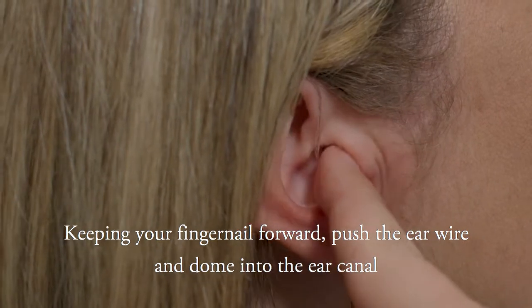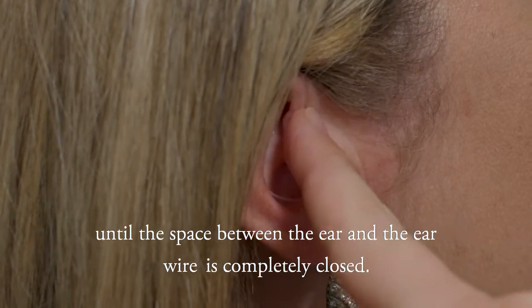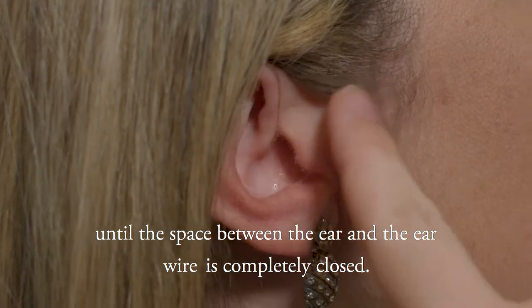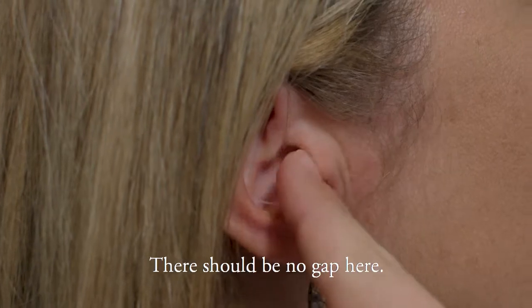Keeping your fingernail forward, push the ear wire and dome into the ear canal until the space between the ear and the ear wire is completely closed. There should be no gap here.